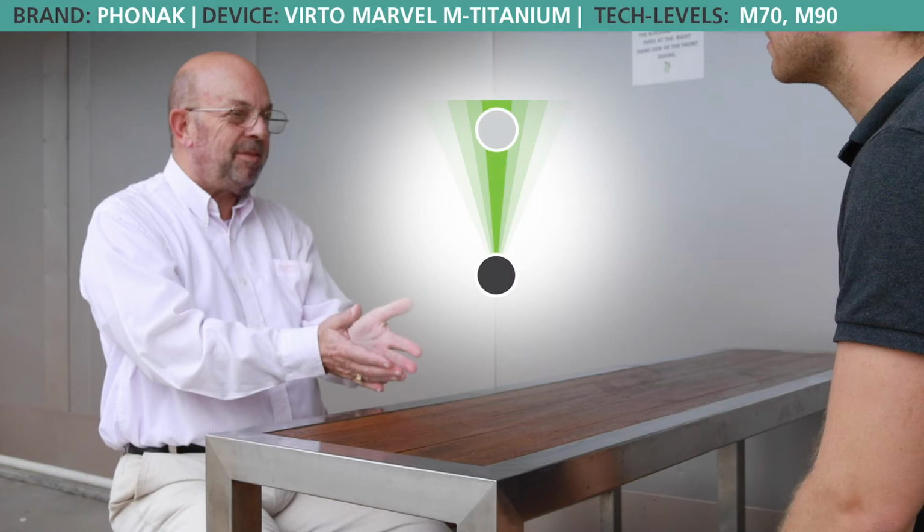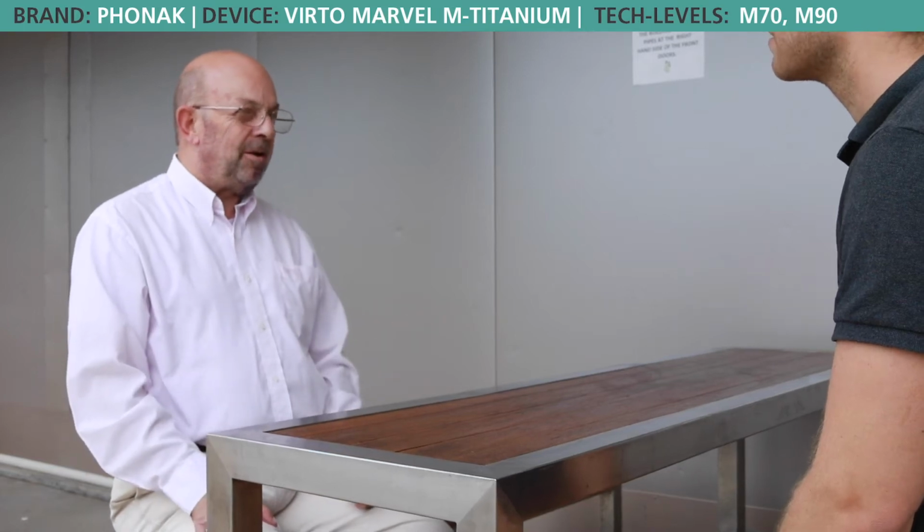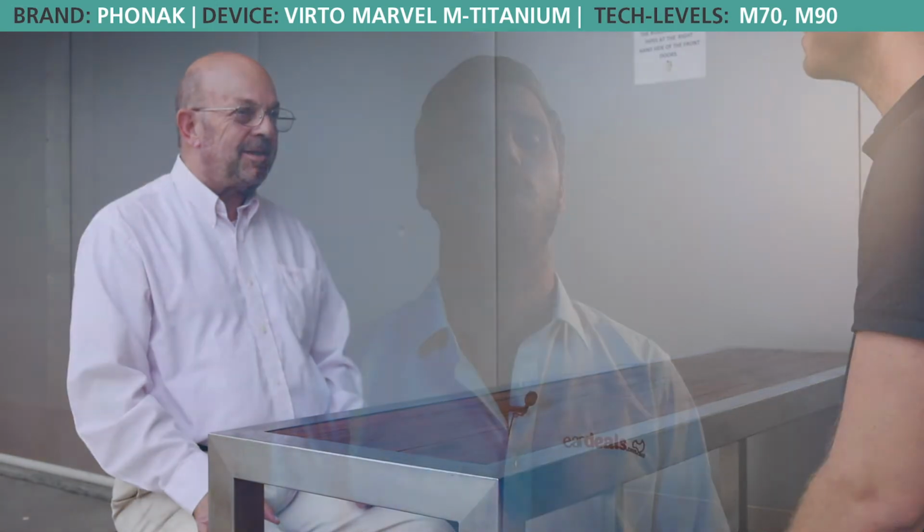This is achieved by the hearing aid adjusting and considering soft background noises in the hearing environment as being less important, thus enhancing the speech that is closer to the wearer and deemed more important by narrowing that focal direction. After all, speech and noise is considered one of the most important areas of a hearing aid fitting because it's typically the place where someone with a hearing loss would struggle to hear.